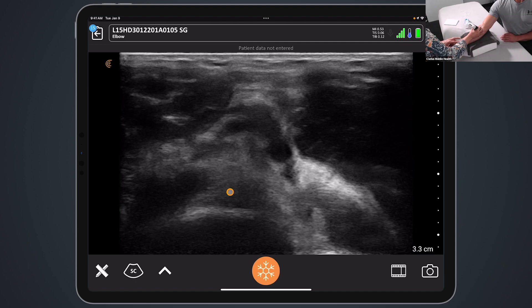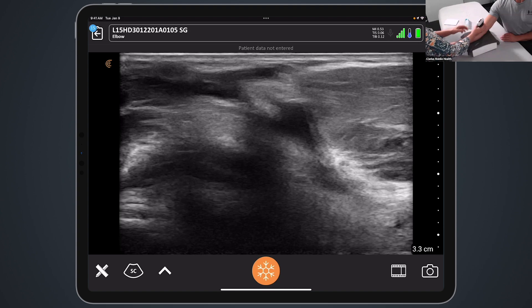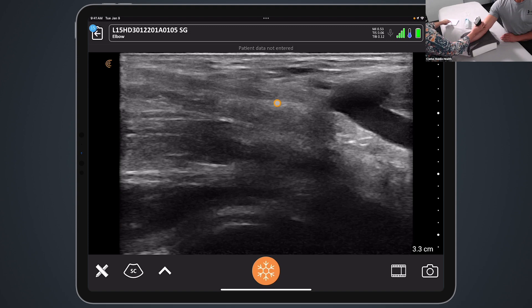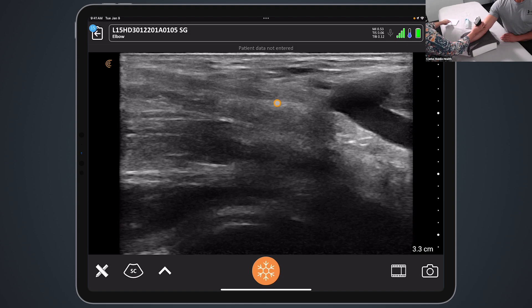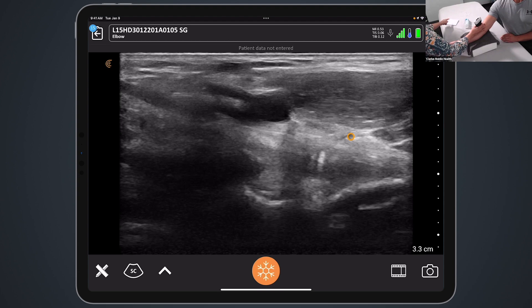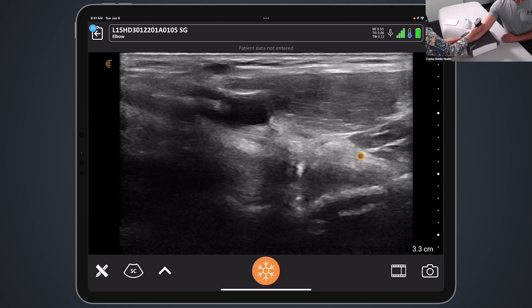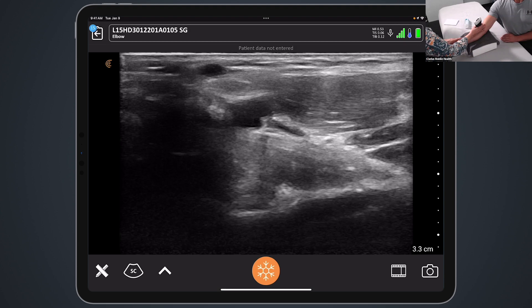You're quite close to the insertion there. If I rotate the scanner into long axis, we get a long axis view of the biceps tendon. I'm seeing some of the fibers here, and if I scan a little bit more distally we're still seeing it, though it gets more challenging down further as I approach the radial tuberosity. The key is maximum supination of the patient. This is a bonus from the ventral approach — I never expect to see the insertion to the bone from here. For that, I want to use the dorsal approach or medial approach, but this is good.